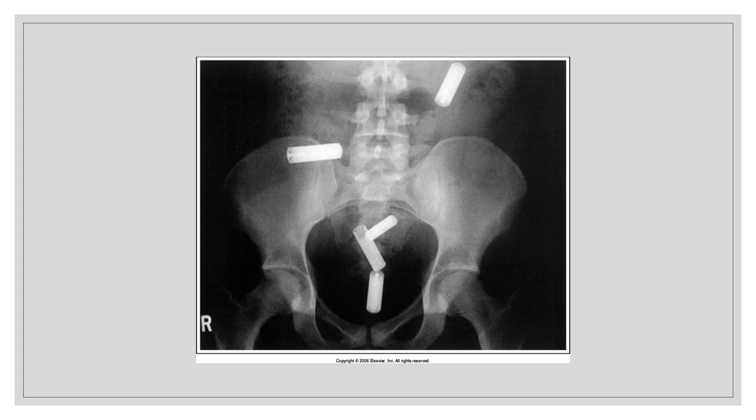What type of artifact? Internal. Batteries that were either ingested or inserted.